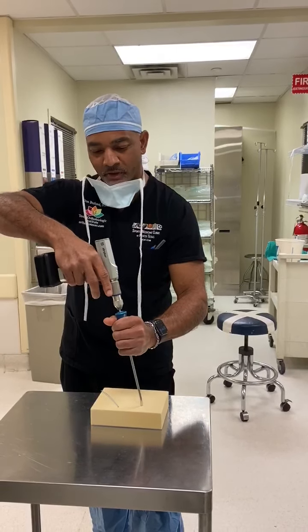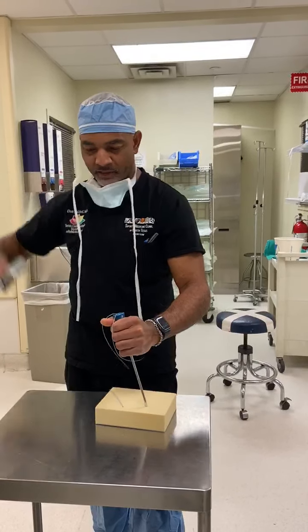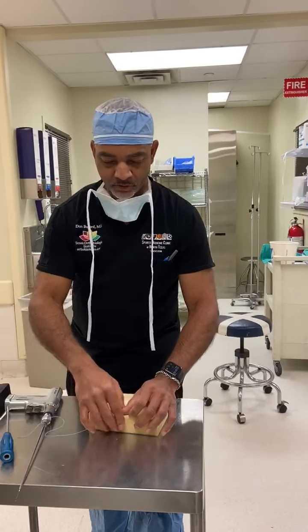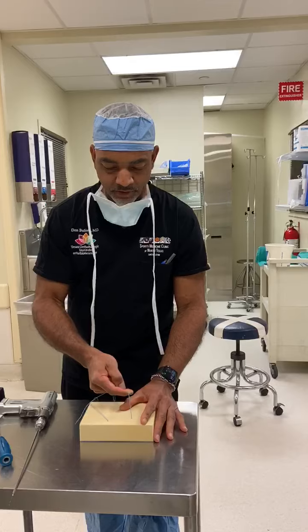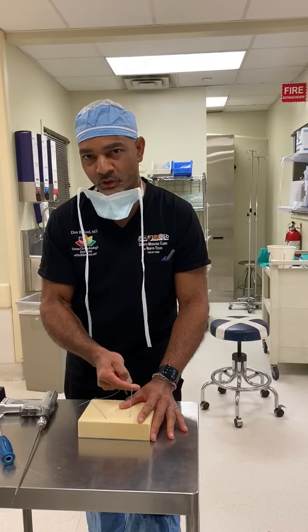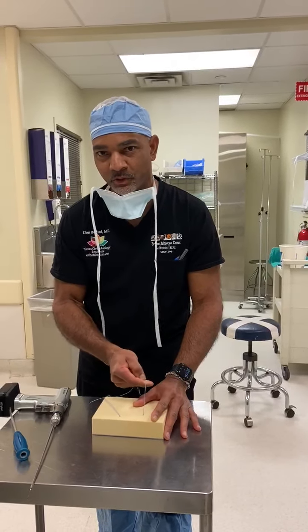Hard stop, and then here's the cool part: pull back and the anchors are already down. So like most all-suture anchors, we seat it by pulling back — and you can see how solid that is. So now we have a one-step insertion for an all-suture anchor right off the drill. Super cool. Thanks.